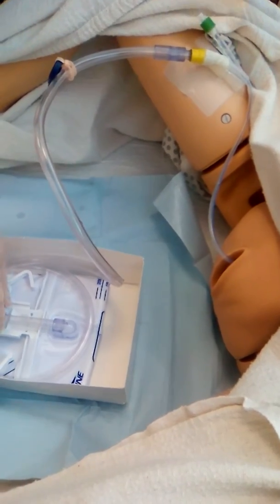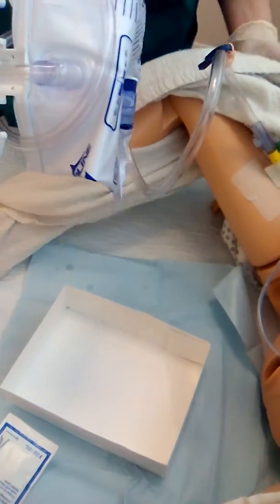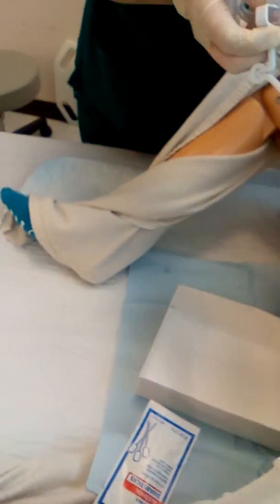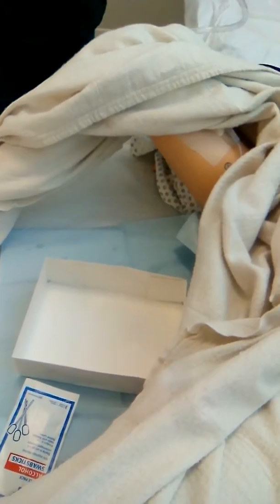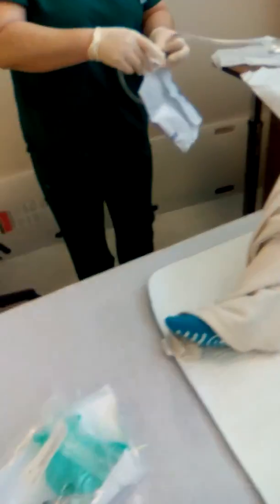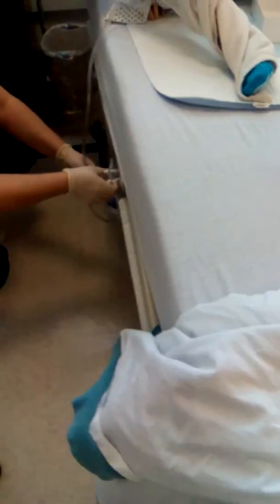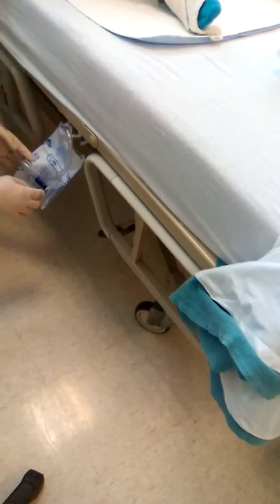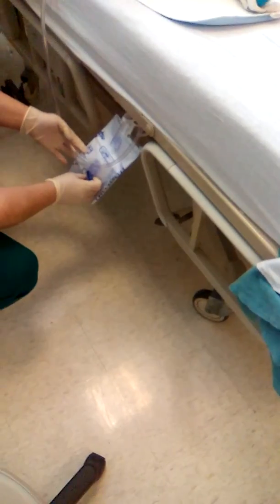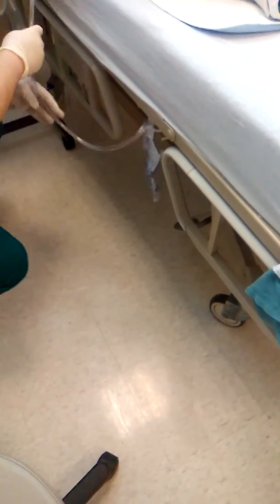I will then connect my drainage bag to the bed frame. I would ensure that it does not touch the floor and that it is not hooked to any side rails, and double check to make sure my port is closed.